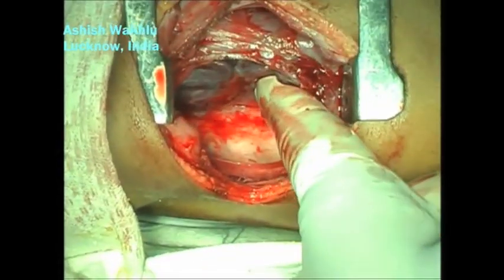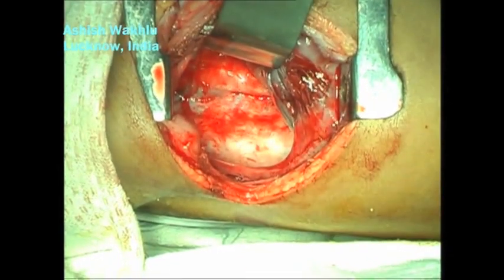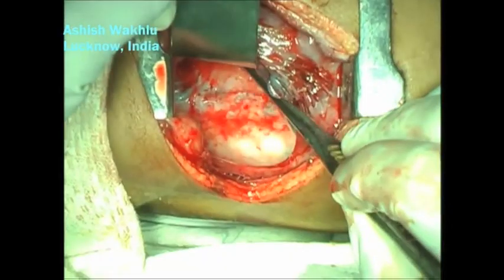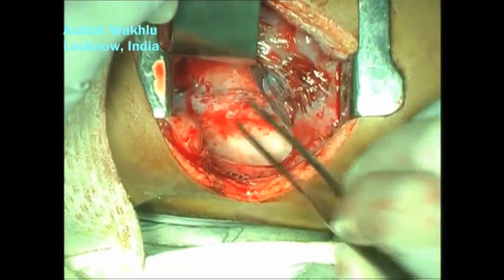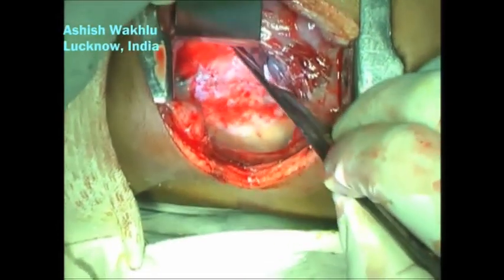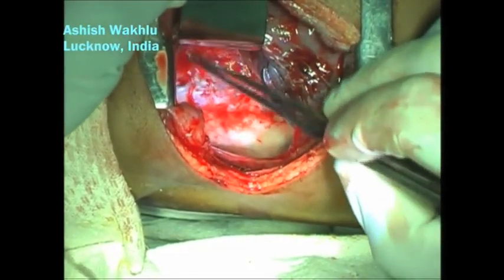As there was no length of bronchus on the right side at all, it is important to mobilize the lung completely so that we reach the bifurcation of the trachea at the mediastinal level to perform the anastomosis of the stump of the right bronchus to the bifurcation of the bronchi in the lung.